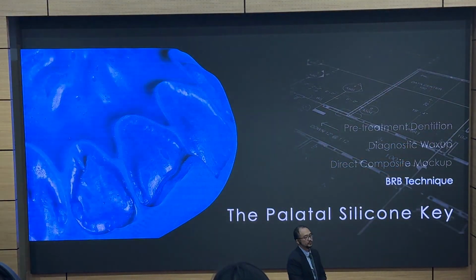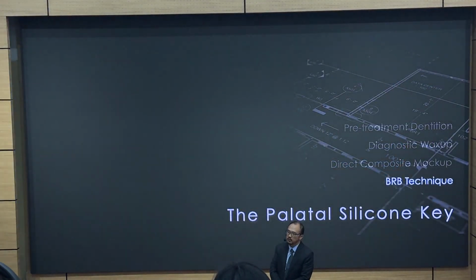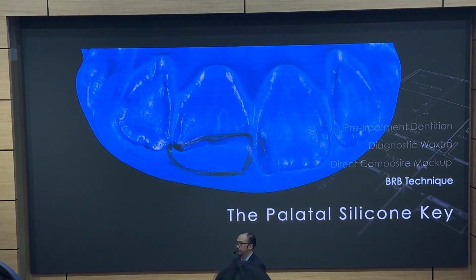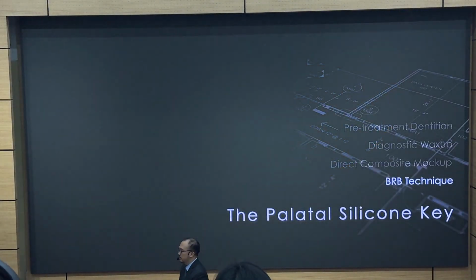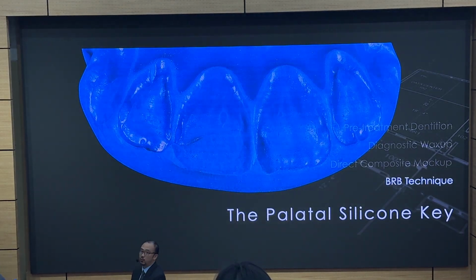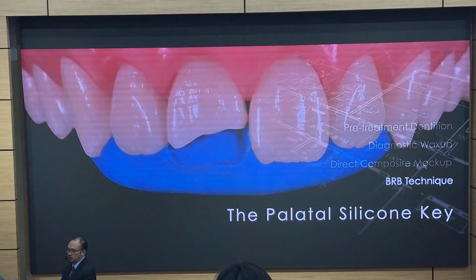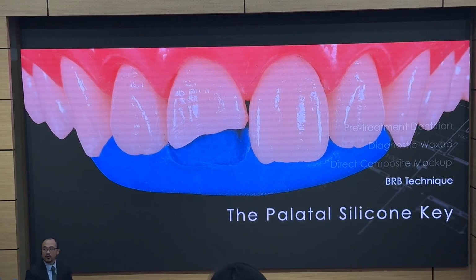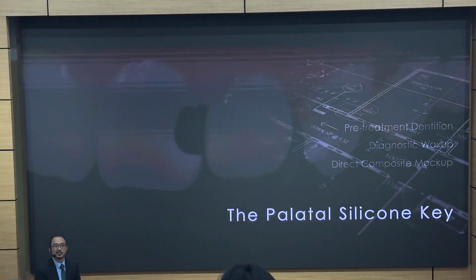You take it out, you use a pencil to roughly mark out where the tooth should be. You use a drill or bur to grind that out. It's not going to be very exact, but it's going to be better than doing it freehand. Then you put it back inside the patient's mouth. Okay? I use this method a lot, you know where? For class 3s, for multiple class 3s.